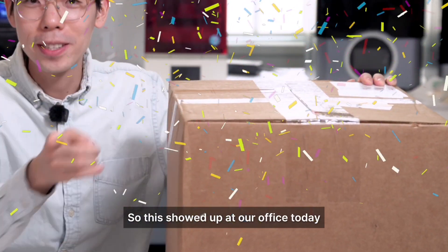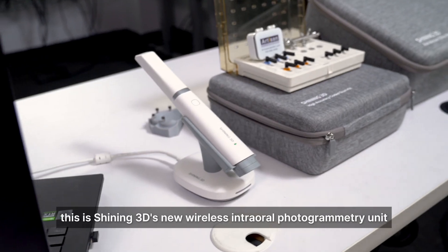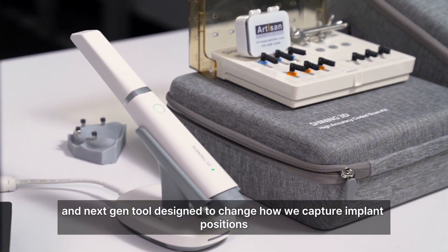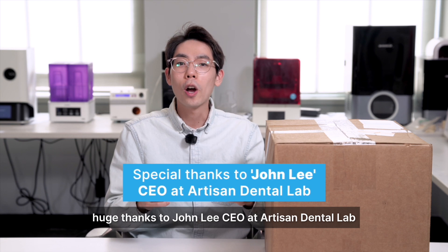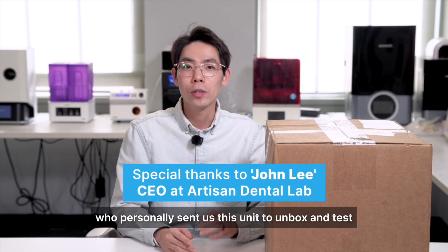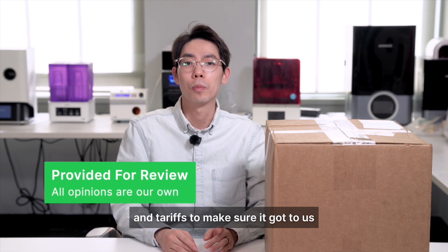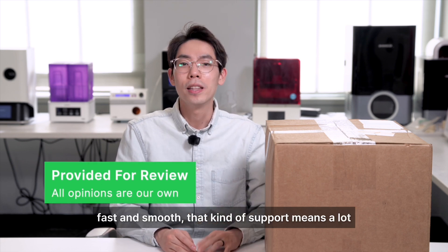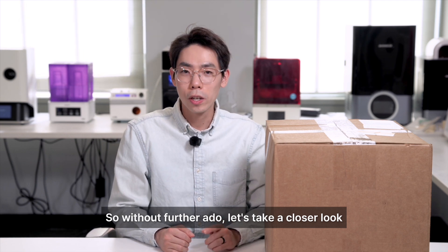This showed up at our office today. This isn't just any scanner — this is Shining 3D's new wireless intraoral photogrammetry unit, a next-gen tool designed to change how we capture implant positions. Huge thanks to John Lee, CEO at Artisan Dental Lab, who personally sent us this unit to unbox and test, and even covered all import duties and tariffs to make sure it got to us fast and smooth. That kind of support means a lot. So, without further ado, let's take a closer look.